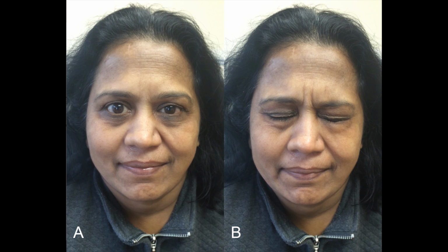Finally, we'll view the operative video, showing the main stages of tumor removal following the bony exposure. For a detailed look at the transtemporal drilling technique, please see the other videos available on this channel. Thank you. Now let's watch some video.